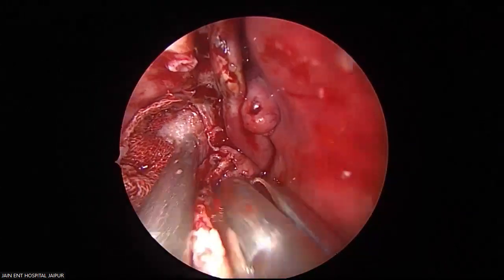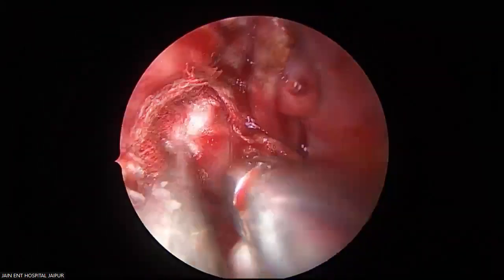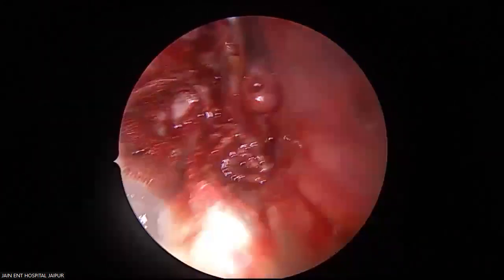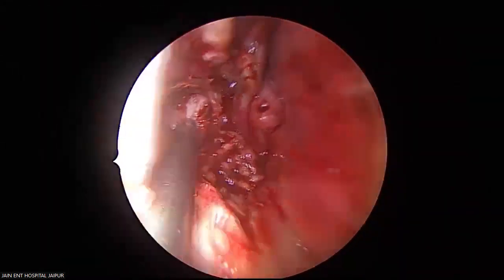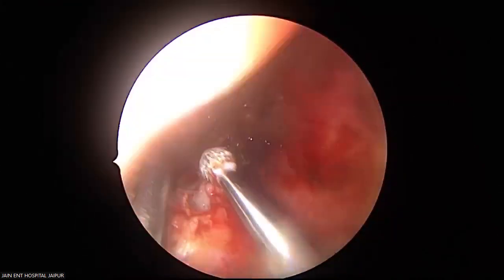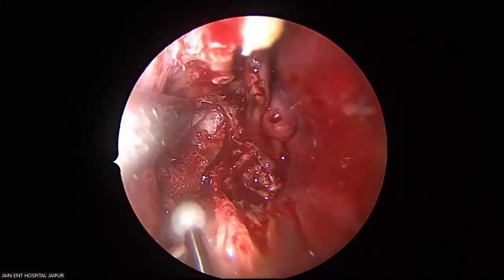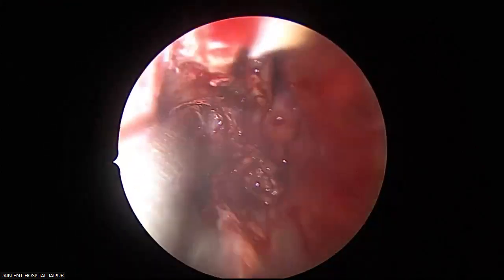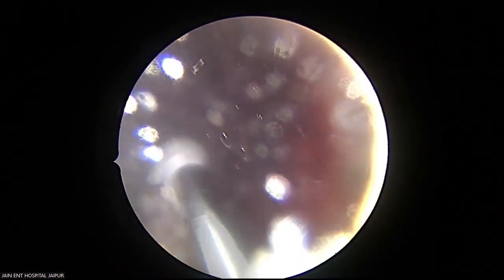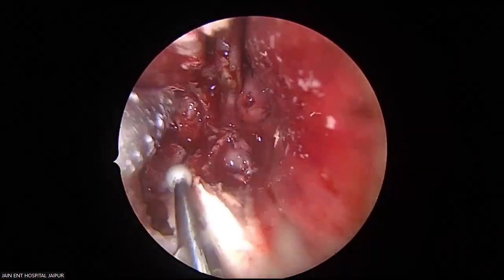Keep removing the bone. Now we will flush this with the floor. See this with the nasal floor. If you don't flush it, this will hamper your instrumentation in the depth.